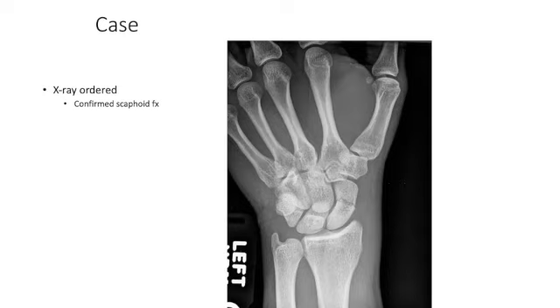So we got another x-ray ordered. We took a look at the PA view, and we can see a nice big fracture line happening here. So just be aware of how these views can work. Be aware of the clinical signs and symptoms. Like I said, a lot of this course is decision making. We're going to use diagnostic imaging as a way to see what's happening on someone's insides without an invasive procedure. So just be aware of these things.